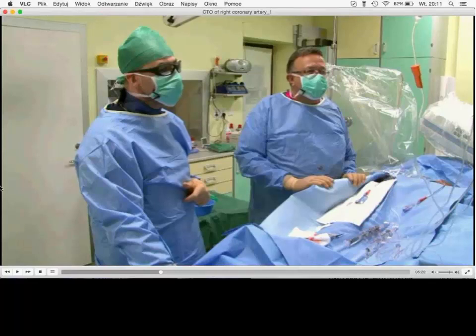But finally, I completely agree with you that hybrid approach is the best option. Yeah, I think hybrid doesn't tell you, I mean, it tells you to change something, but whether you're going to do parallel wiring or whatever, the principle is that you do something different if something doesn't work. And I think everyone agrees, as you said, that if something doesn't work, do something else versus try for many hours to do the same thing.